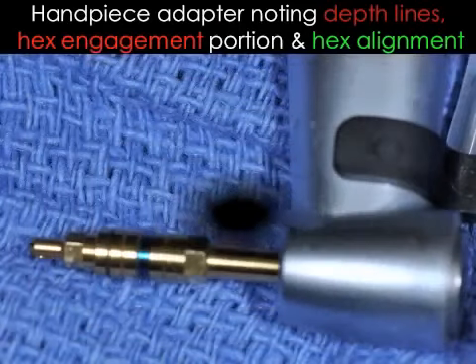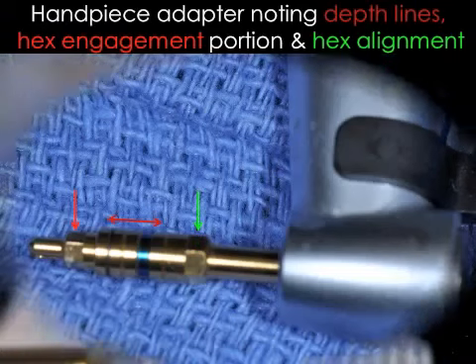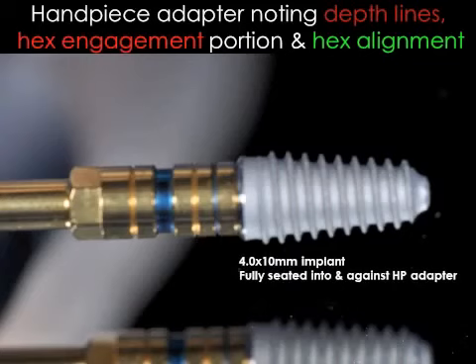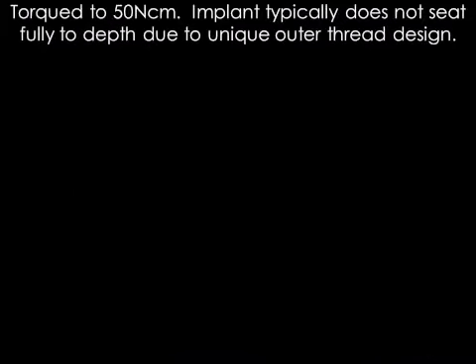Really look at the handpiece adapter here. You can note the different depth markings on there, and you can see where it engages with the internal hex, and it also shows the hex indicator for your aligning of the hex itself. The markings on your depth gauges there are 1, 2, 3, 4, and 5. You can note again the hex marking showing you all the time where your hex is so you can place it straight facial.